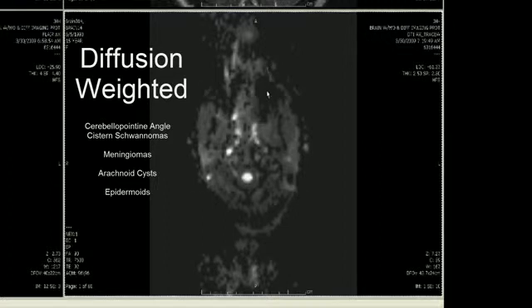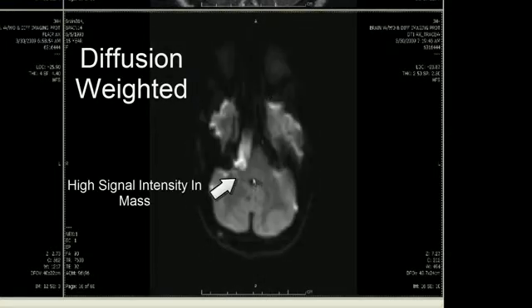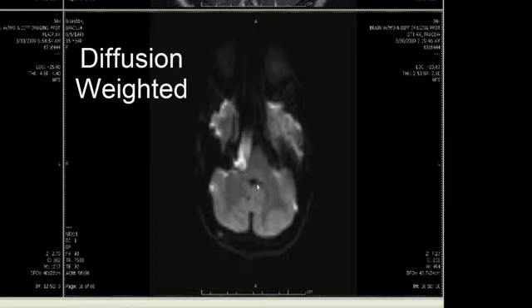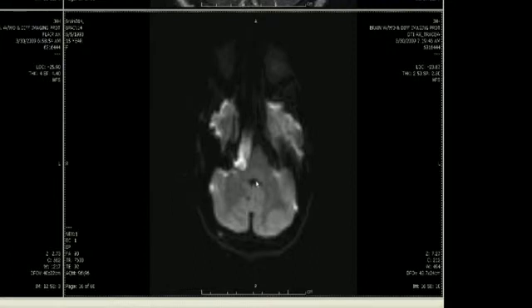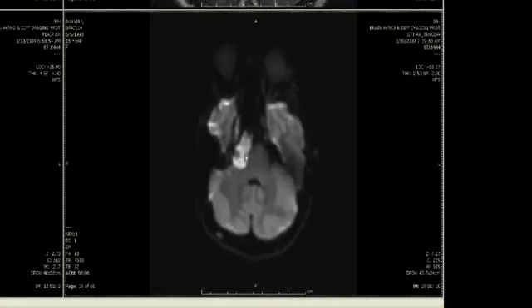In this case, when we scroll through our diffusion-weighted pulse sequence, we see very high signal intensity in the mass. The mass is therefore unlikely to represent an arachnoid cyst, since it does not have the same signal intensity as the cerebrospinal fluid within the 4th ventricle. Bright signal intensity on a diffusion-weighted scan, corroborated with low signal intensity on the ADC map, is highly suggestive of a diagnosis of an epidermoid.